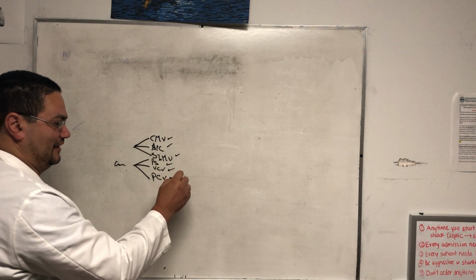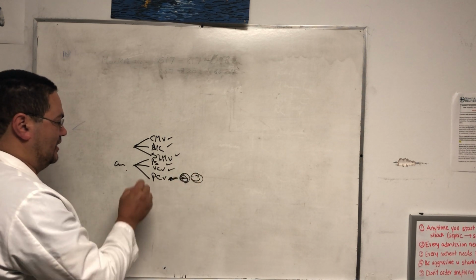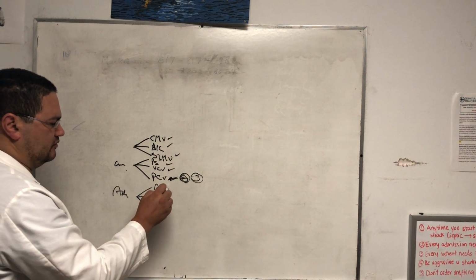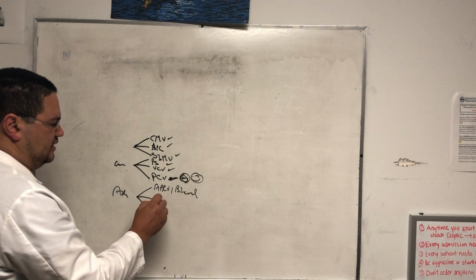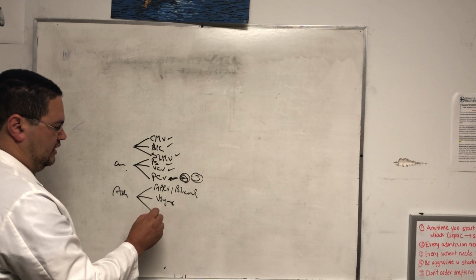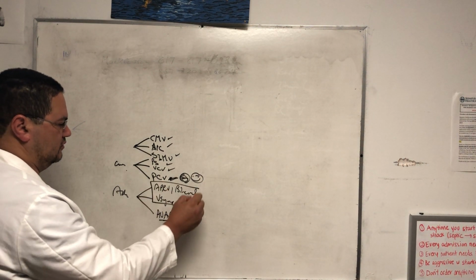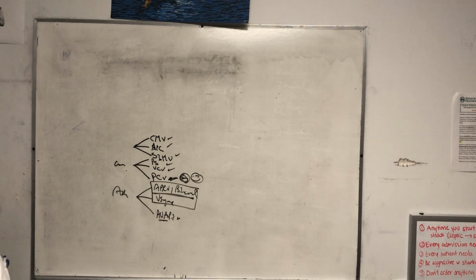We're gonna have to really delay this a little bit till the end of the rotation or something. And there are advanced modes of ventilation. One of them is APRV, bi-level, V-sync, and AVAPS. And we talked a little bit about AVAPS before. So we have these 2 to talk about. I'm going to start with this, and then we'll see if we have time for the V-sync.